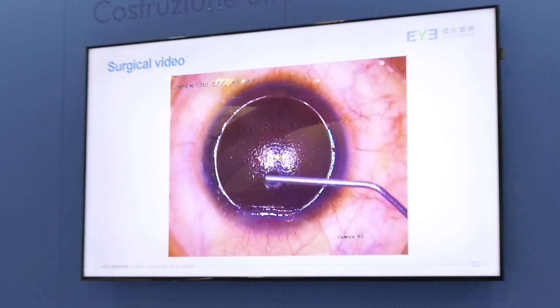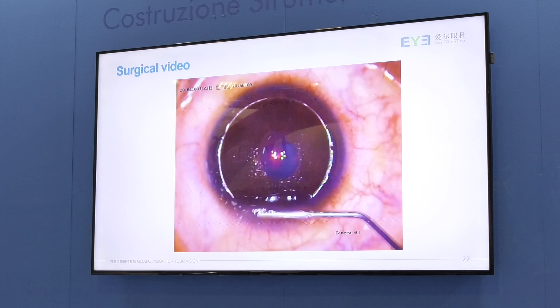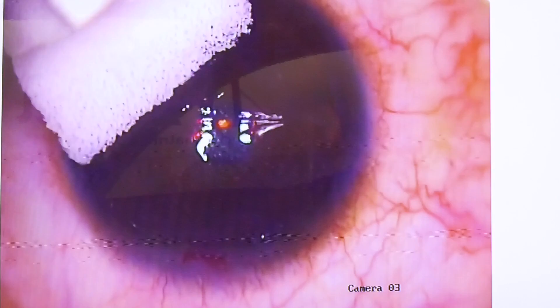We carefully absorb the excessive fluid from the surface and let the lenticle dry. Here you can see the lenticle becoming dehydrated and secured on the stroma bed. Then, like what we do for LASIK, we put a drop of fluid and then replace the flap. It's important to avoid irrigating the interface because the lenticle can become very slippery. This is essentially how the procedure is done.